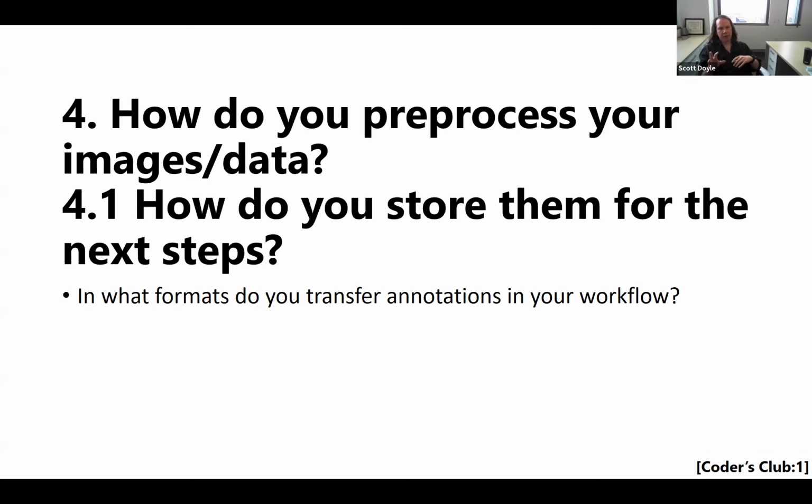I don't know if this is the right place to talk about it, but one of the issues that we run into is the simplicity, but more brute force and inefficient approach, versus a more complex but more efficient approach. As someone who has to deal with a lot of students who don't have a background in computer architecture or programming, it's just conceptually easier for them to understand that they have a bunch of images in 2 different folders, and they can tell PyTorch, here's an image folder, the classes are subfolders, now train.